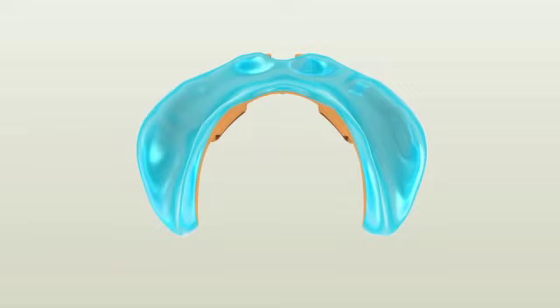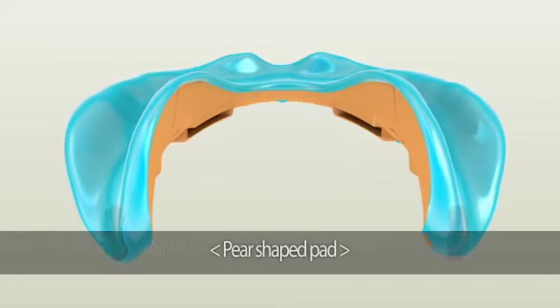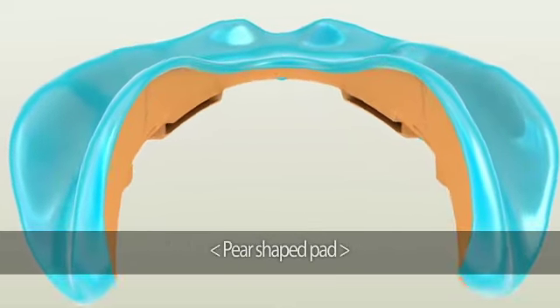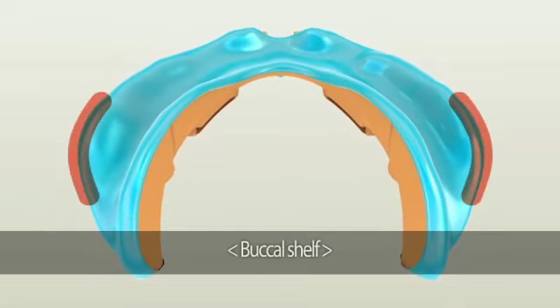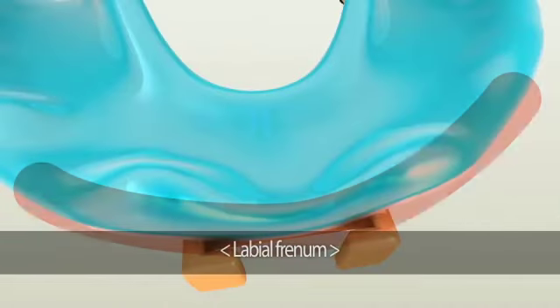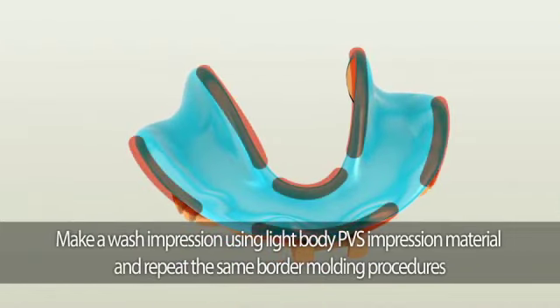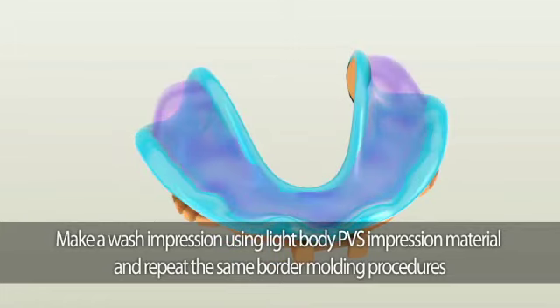The second area to check is whether all the landmarks are duplicated. This includes the pear-shaped pad, buccal shelf, lingual flange, and the frenum areas. To make the wash impression, we recommend using fast-setting light-body PVS material such as Flexi-Time Fast and Scan. Lightly cover the entire area with fast-setting light-body PVS material and repeat border molding procedures.